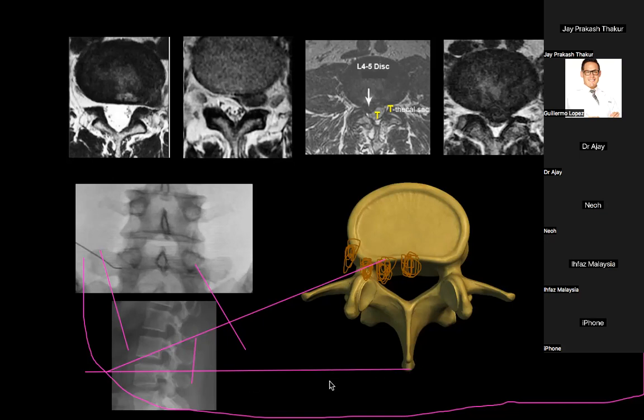Will this be constant in all the patients? Is it possible? No. A patient who is less bulky, a thin patient, maybe the distance may be this much. It all depends on the patient to patient. So don't go by fixed centimeters and fixed degrees.